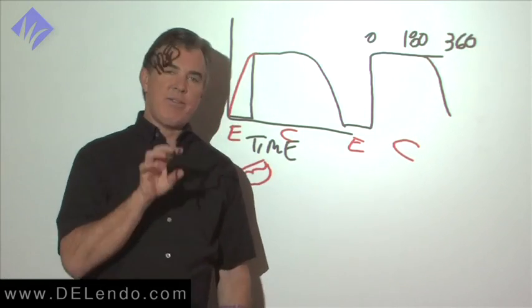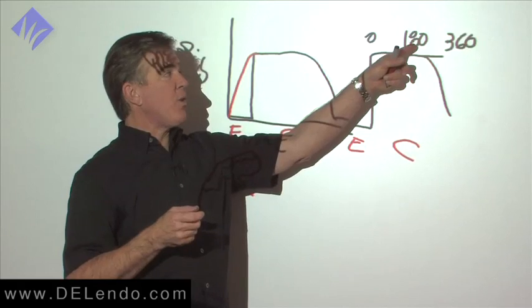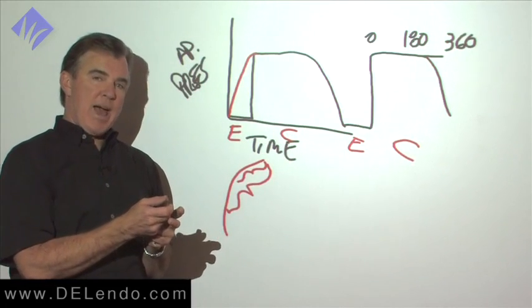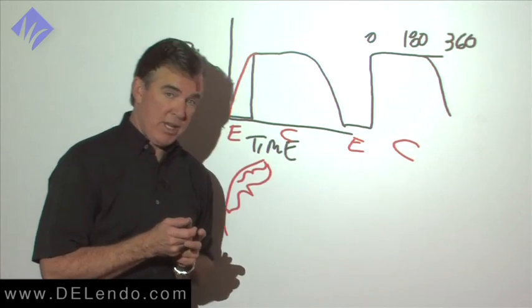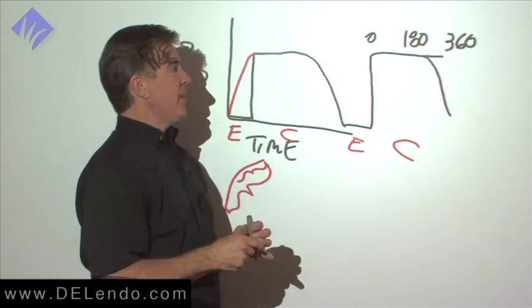If you have the situation where you've over engaged the blade, you're past 180 and you're not feeling any give, just release some apical pressure, let the file back out a quarter of a turn, reapply pressure, make that cut, go to the previous position, make that cut, and you'll be good.